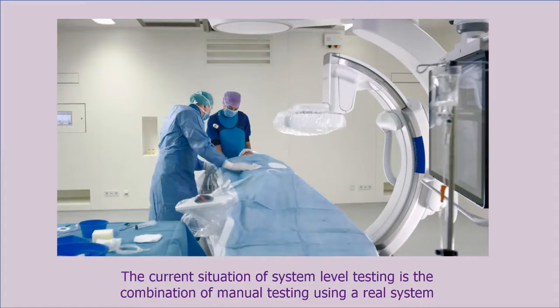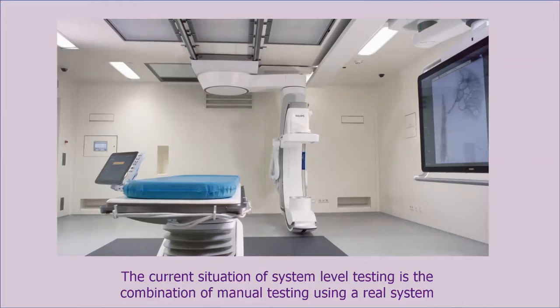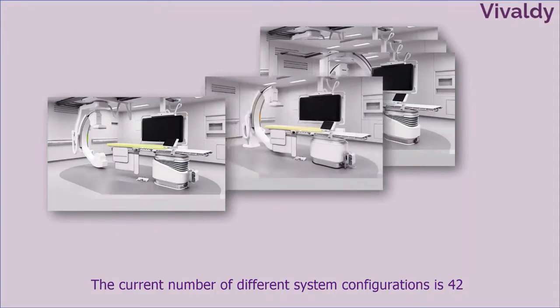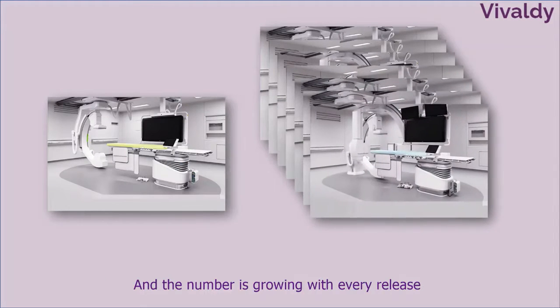The current situation of system-level testing is the combination of manual testing using a real system. And not just one real system. With 14 different C-ARC combinations and 3 different patient tables, the current number of different system configurations is 42. And the number is growing with every release.